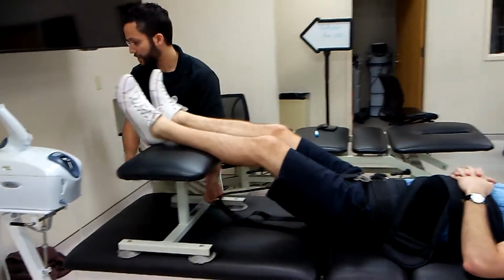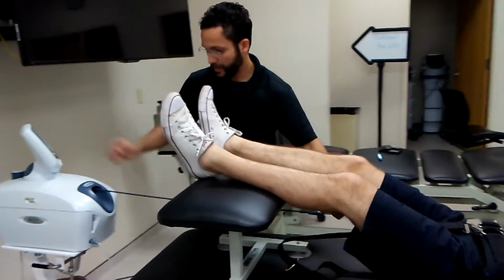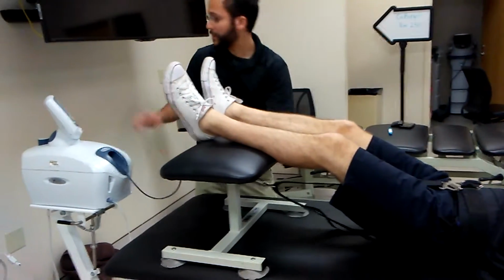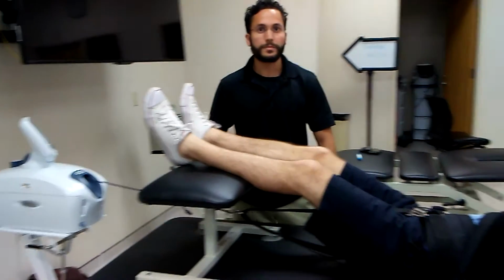Next thing we do is we're going to release the rope, making sure that it doesn't hit the prop up, and then we're going to tighten the rope, and we're all set.